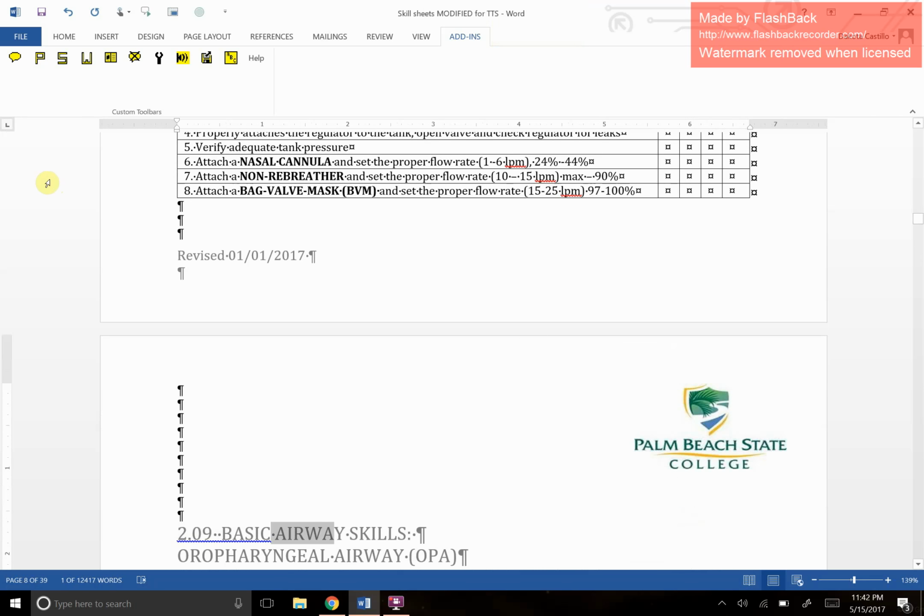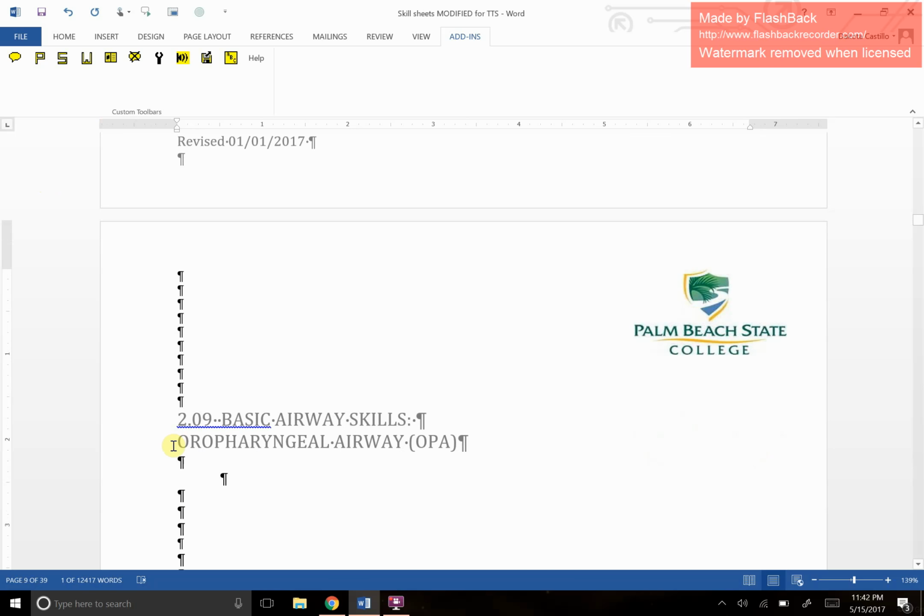2.09 Basic Airway Skills. Oropharyngeal airway, OPA.